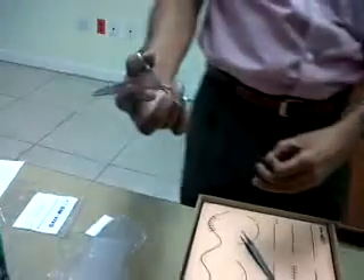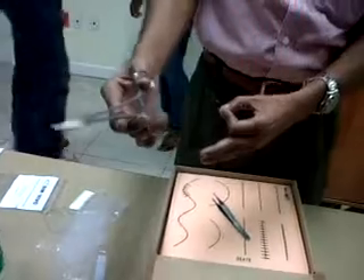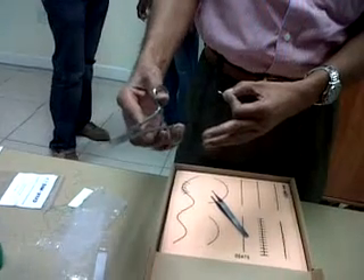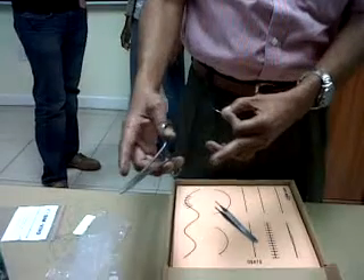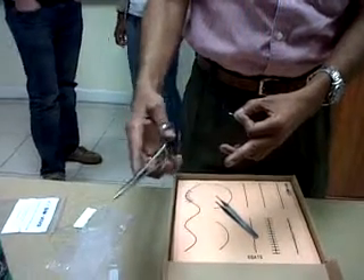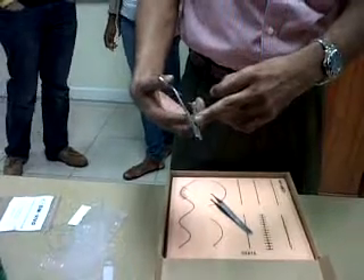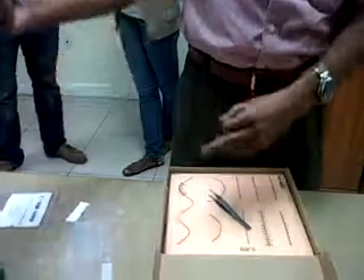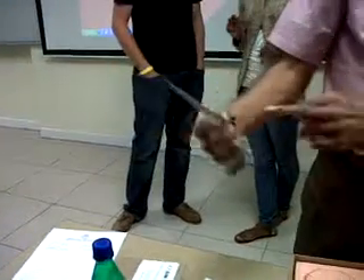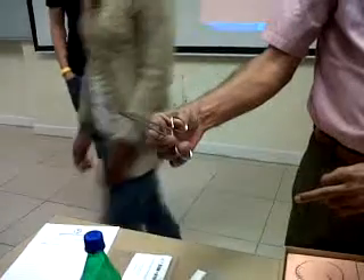The technique of holding these instruments: the ring finger goes into the lower ring, the middle finger rests on the outside. This is the joint and this is the fulcrum. Most instruments have three clicks of the ratchet — one, two, three.